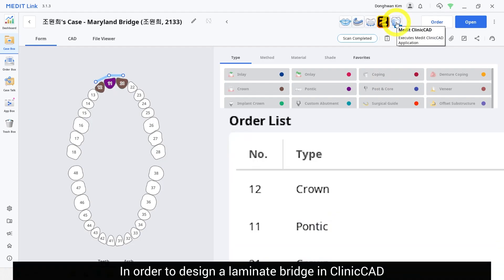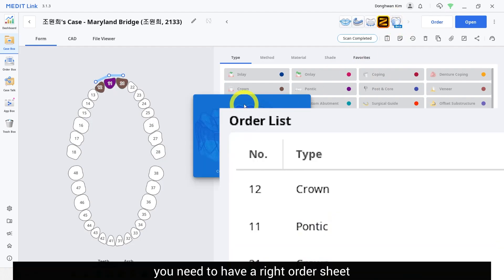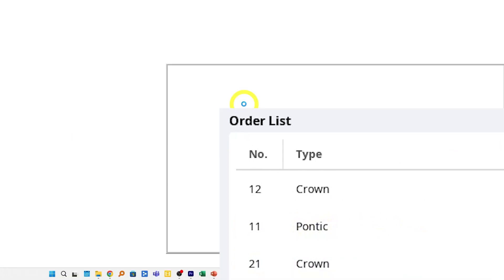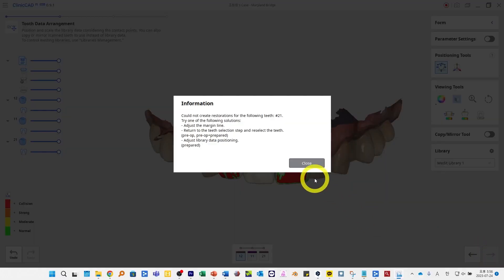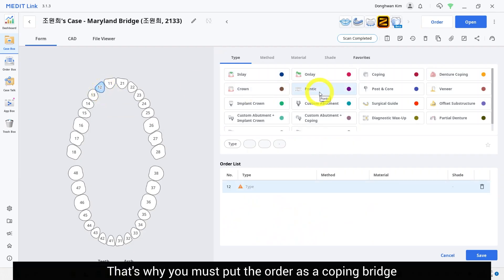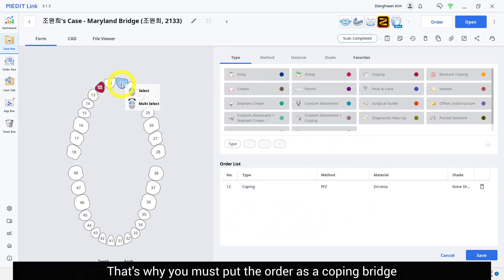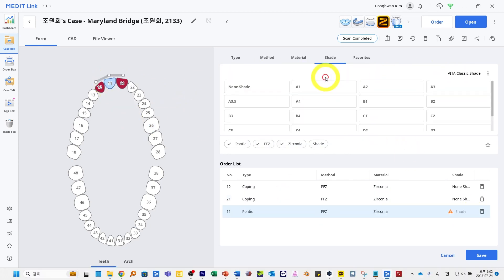In order to design a laminate bridge in ClinicCAD, you need to have the right order sheet. You will notice a problem if you order with crown bridge. That's why you must put the order as a coping bridge.